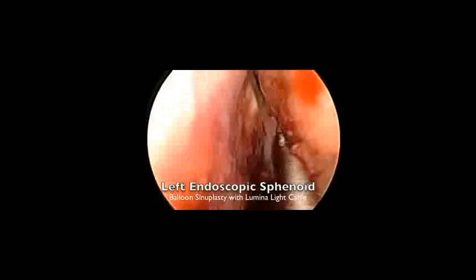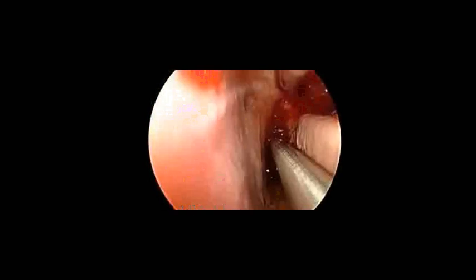Approaching the left side first, the middle turbinate is outfractured gently with the caudal freer. The superior turbinate is seen at the tip of the freer. The septum is on the left. Image guidance is also used to help identify the sphenoid ostia, but is not placed through it in order not to damage the natural ostium. We see the area of the sphenoethmoidal recess where there's polypoid disease at the area of the sphenoid ostium.